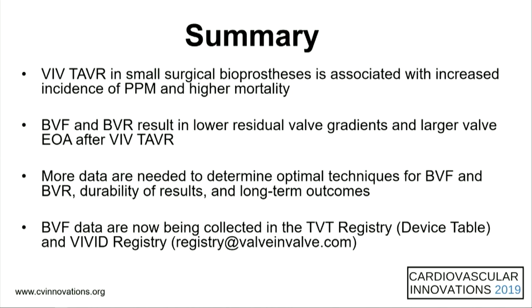So in summary, valve-in-valve TAVR in small surgical valves is associated with increased incidence of PPM and higher mortality. BVF and BVR result in lower residual valve gradients and larger valve EOA after valve-in-valve TAVR. We need more data regarding durability of results and long-term outcomes.